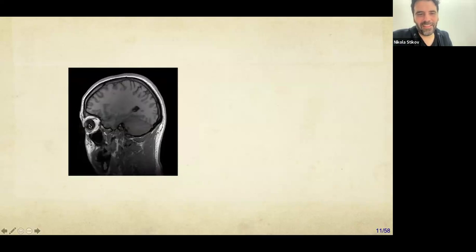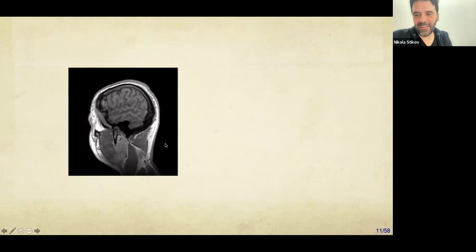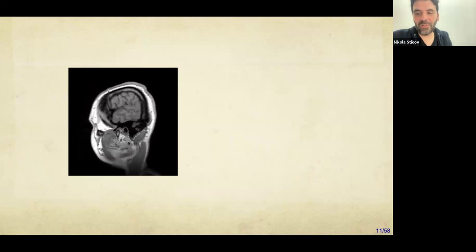Interesting thing to notice. See how the nose of this person kind of comes around to sniff the back? See the nose right there? Everybody see that? So that is called aliasing, and it's a problem in MRI. I'm going to explain to you how that happens.